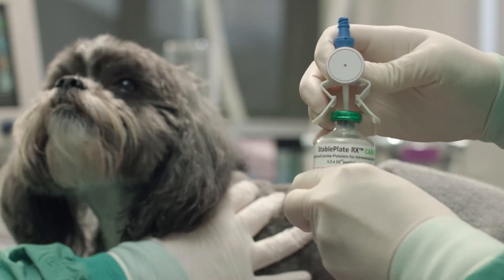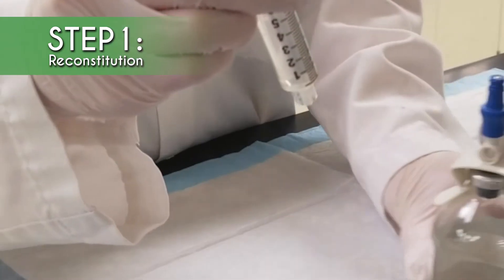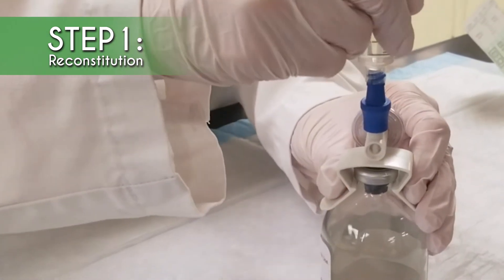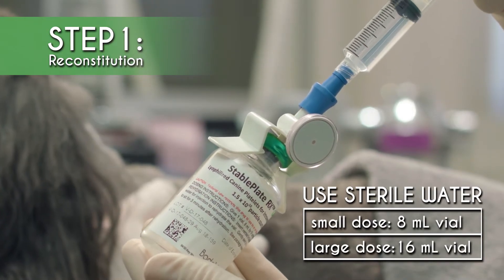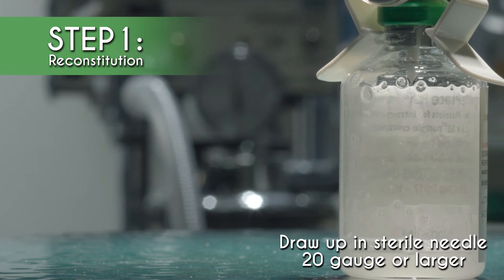Before using, it needs to be rehydrated with sterile water using the enclosed sterile clave, which is a needleless connector with lure lock. Insert the syringe into the top of the clave and point the stream towards the side of the vial as you slowly inject the sterile water, fully immersing the cake. Gently mix by swirling the vial and allow to sit for three to five minutes before using.